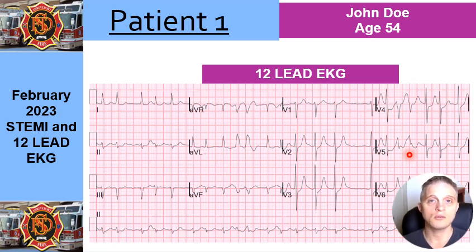You need to be able to interpret the 12 lead, because that's why we went to classes and have this task. And so the first thing is that you need to identify rate, second, rhythm, third, P-wave morphology, fourth is QRS morphology, and then you're going to identify the T waves, the ST segments, and then your axis. So we're going to talk about that, and then we'll briefly go over them in the additional 12 leads that we're going to go over.